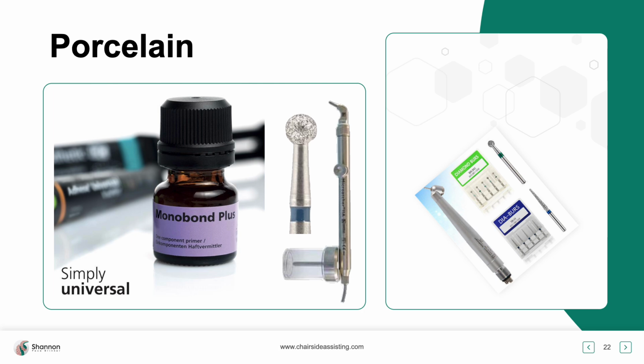And that is something that I want you to really pay attention to. If we have an area where an attachment came off, let's say it's on natural tooth structure, I would utilize either a Super-Snap sandpaper disc from Shofu, which you have in your box, or I would utilize a little ET carbide. I would have my doctor roughen up that area because it's very hard, if they lose an attachment, to just go and acid etch that area and rebond. I want a clean surface again to bond to. And something must have happened. It could have gotten wet. Patient could have been taking these on and off.